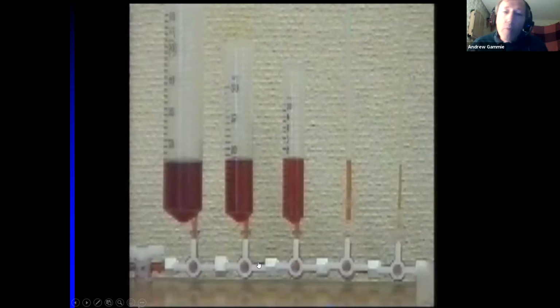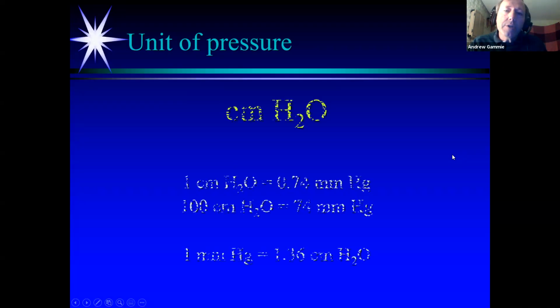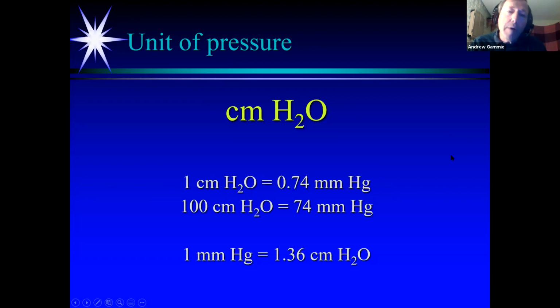What's happening here? Well, gravity is pulling on the water. And if I were in a room with you all now, I would ask you, what direction does gravity work in? It's the trickiest question of the evening. It's vertical. And so the force that is creating the pressure on my ears is only acting vertically. And so the change in pressure is going to be determined by the vertical height of water above me. And that is why in urodynamics we use the unit of pressure as centimeters of water.